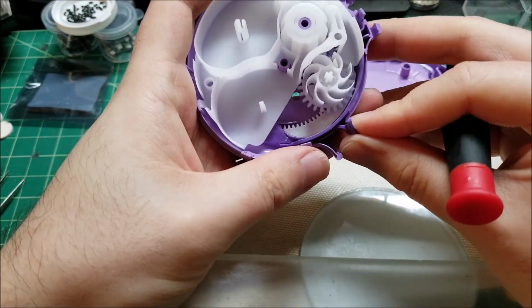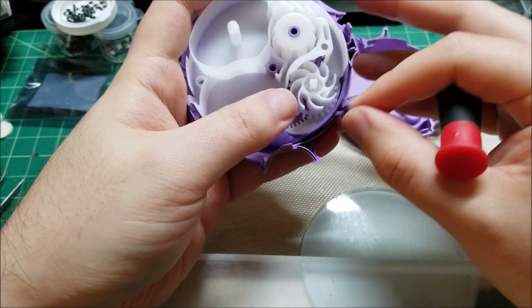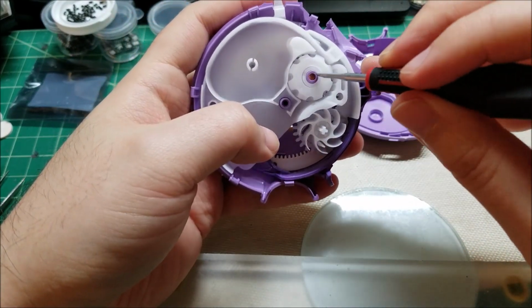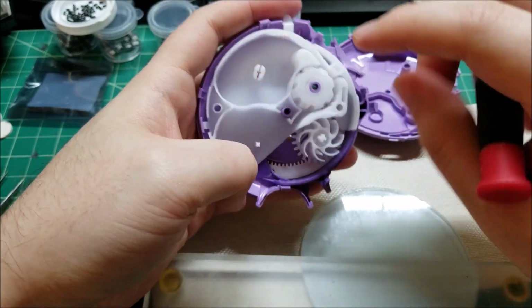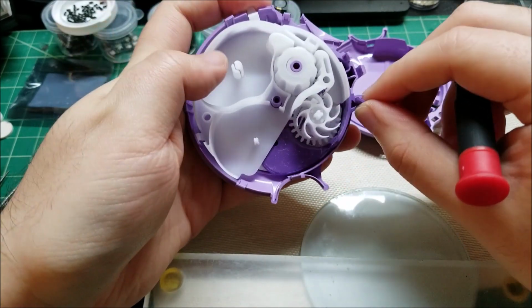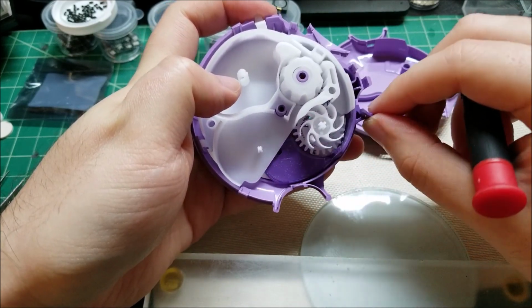And so let's see. Yeah, you can see as it primes it, it ratchets this wheel and this wheel. I'm guessing this is like a pinch roller almost, so it'll take up the spent capsules. And you can see even this side rotates. There's little teeth, so it can keep tension on the spent side.